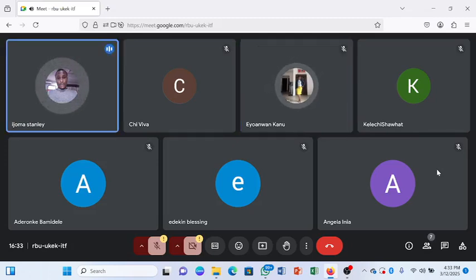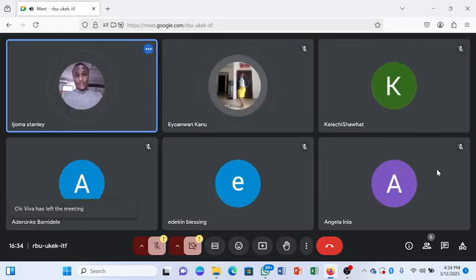Okay, it's calibration. So when you go in there, even in the pharmacy where they do all the wholesale, and you say you want a 23 needle, you'll be expecting the bigger needle, the smaller needle. But it's not. The 21 is bigger than the 23. So the smaller the number, the bigger the needle. So that is it for needles, so that we don't dwell on this.